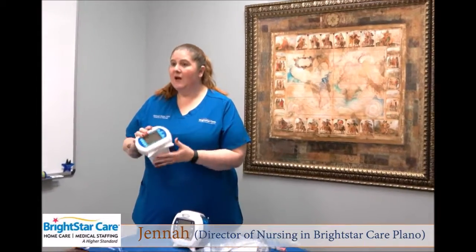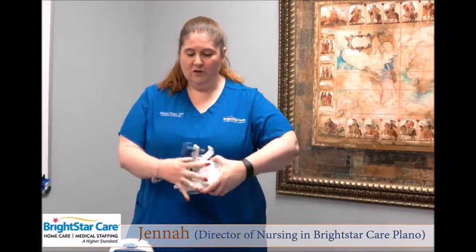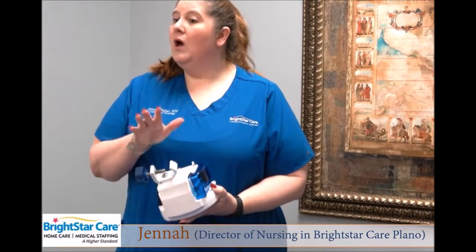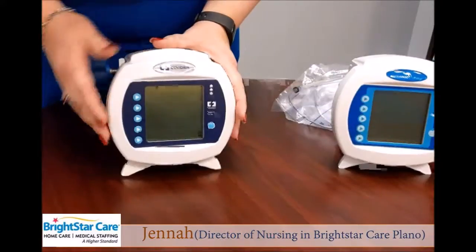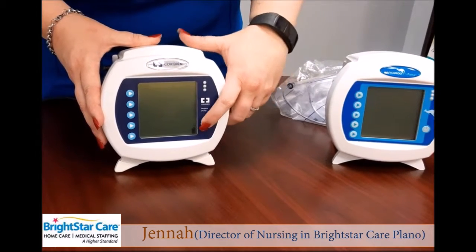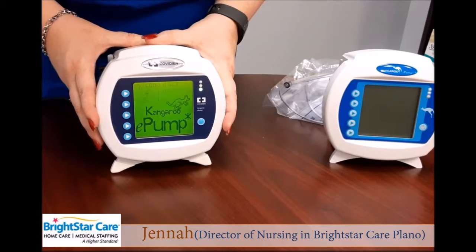One is set up to run as a battery unit. One is set up on a charger with an adapter to be screwed into an IV pole or a bedstand type pole for standard feeding when someone is bedbound. On your Kangaroo pump, you'll find the power button in the lower corner. Press and hold the power button to initiate your therapy.